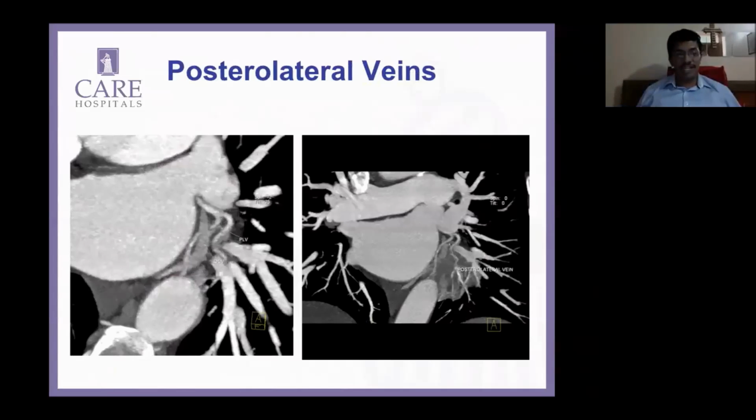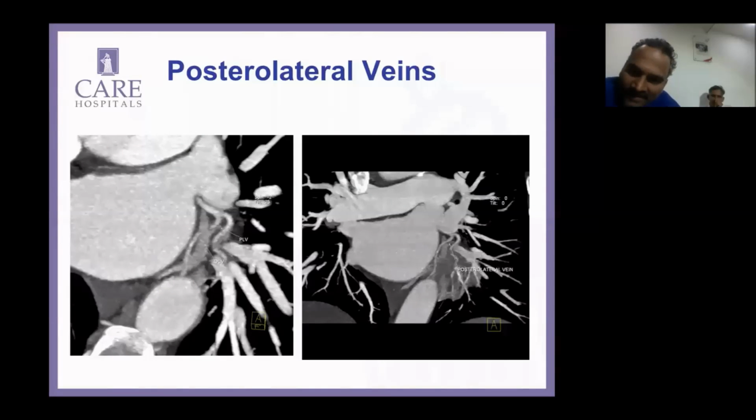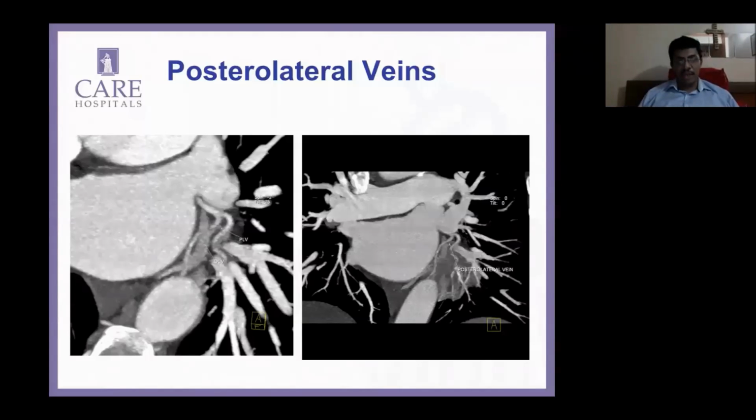It has really tremendously brought down the procedural time for us in our experience. Yes, sir. I mean, it's an eye-opener for me. So coronary artery and vein, we're getting good at this. It's a little tweaking of the contrast, little tweaking of the timing where you want to inject. And remember, these are pretty sick patients, big LVs.